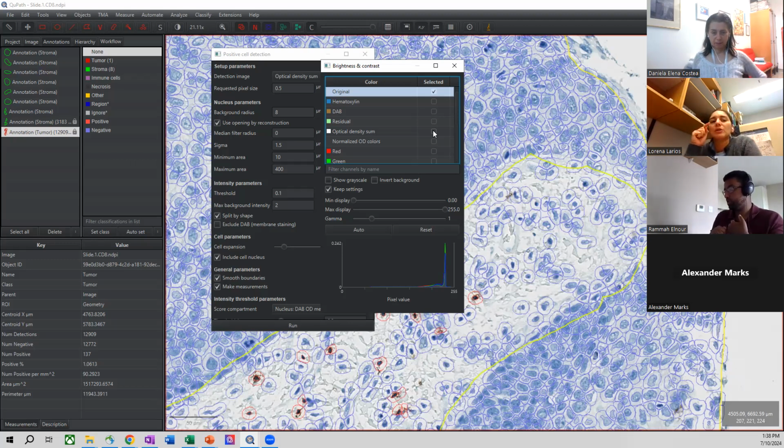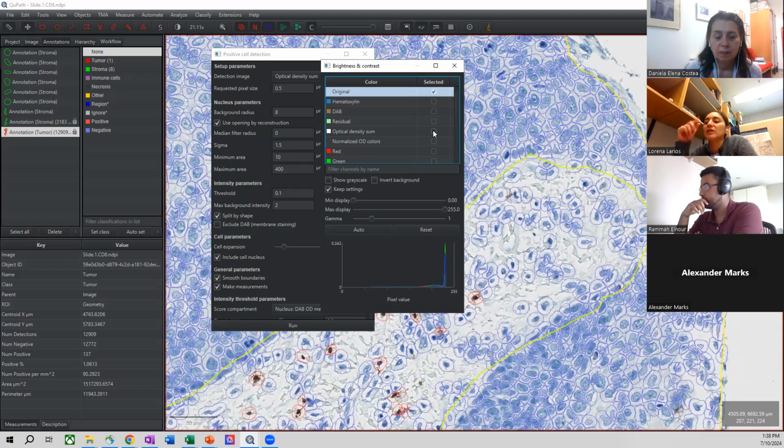Yeah, but my question is, at the beginning, for example in ImageJ, I need to measure the scale first. And when I have the value of this scale, I put these settings in the global image setup, and I can get the area. In QuPath, how shall I start doing that? Any idea? But I can continue in ImageJ, it's just curiosity.